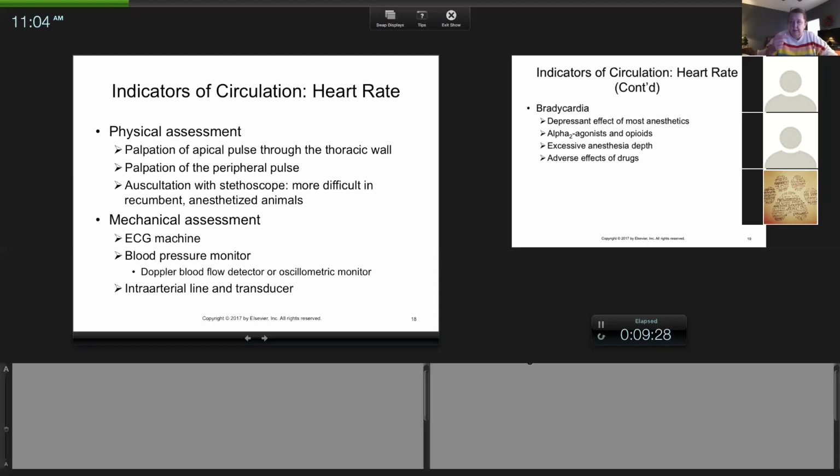It passes down the esophagus, and it looks like a stethoscope without the bell, and you hook it up, and the tubing is in the esophagus where the esophagus passes by the heart. And so you can hook it up without having to reach your stethoscope under the drape and try to listen to their heart. And that's going to give you a heart rate by auscultation, which again is the most accurate. If you can hear the heart beating, your patient's alive. And that rate is always going to be the most accurate.